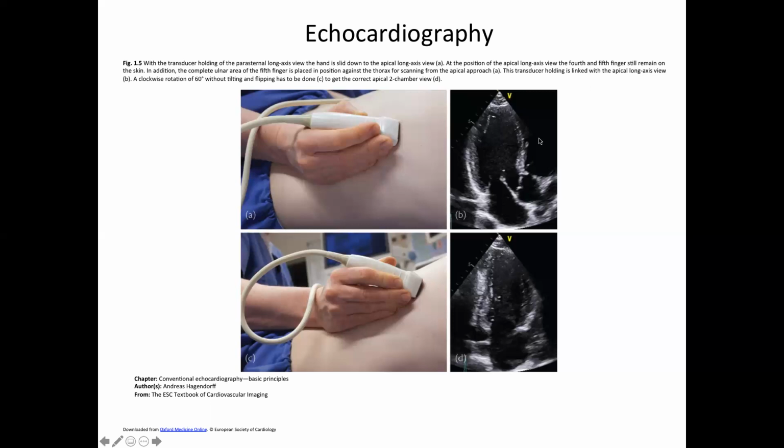This isn't as much. The transducer here sends out chirps of ultrasound, and then it also works as the echolocation device, like a receiver or a microphone essentially, and it picks up reflections as they come back.